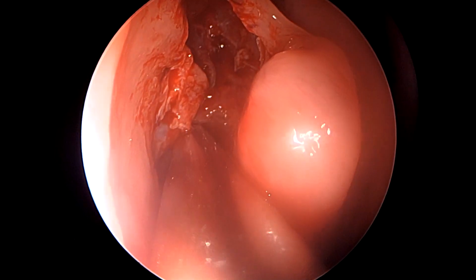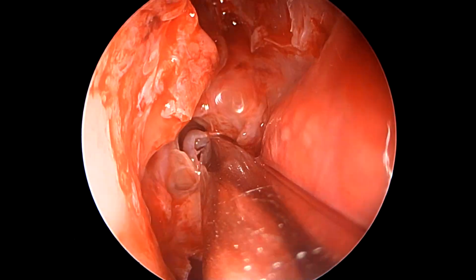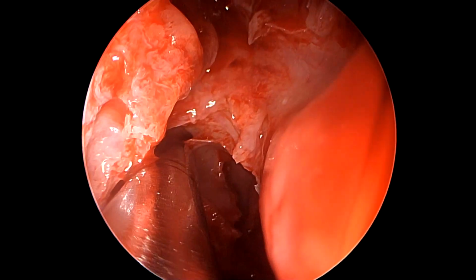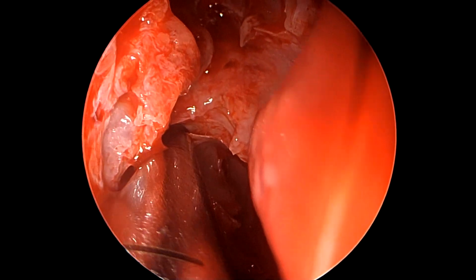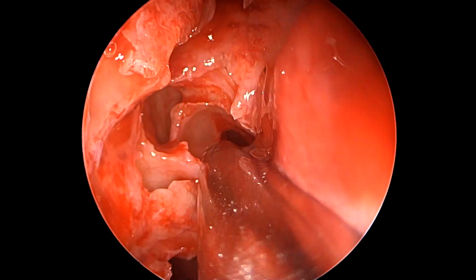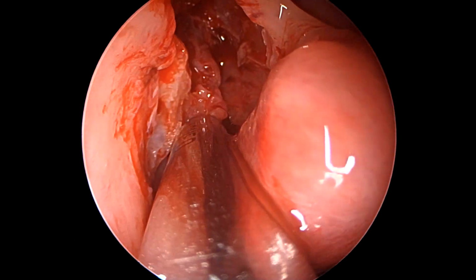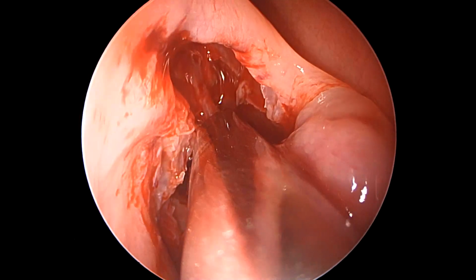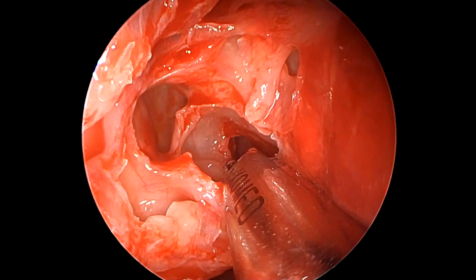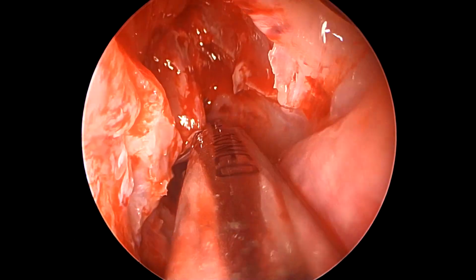This can often lead to new bone formation, osteoneogenesis, vascular proliferation around these new bone vessels, which could lead to persistent and very refractory headaches and such kind of symptoms in these patients. Once we commit to surgery in these patients, it is prudent that we follow surgical principles and remove as much bony septations very clearly, while adhering to our policies of mucosal preservation and not keeping a lot of bare bone inside these sinus cavities.